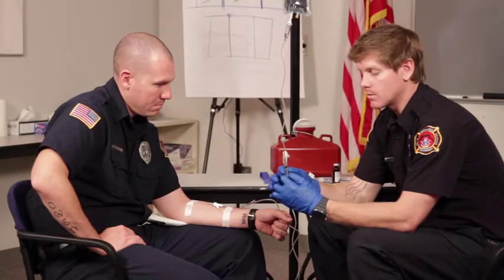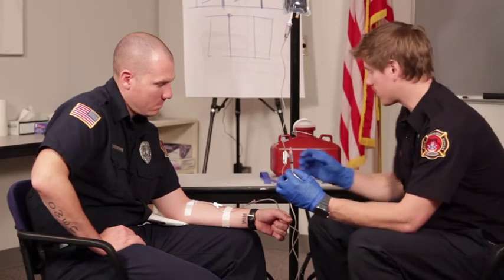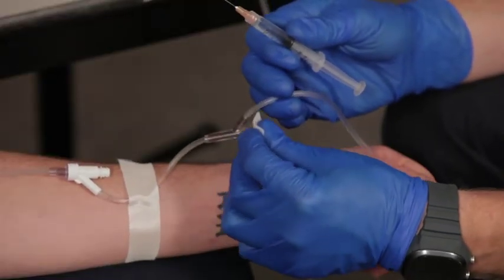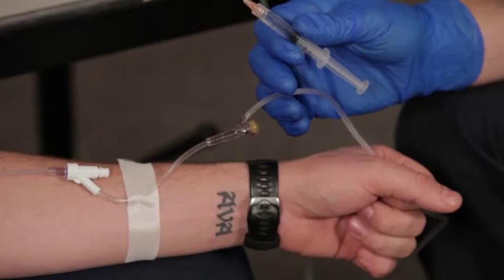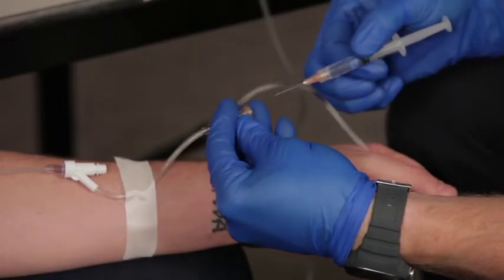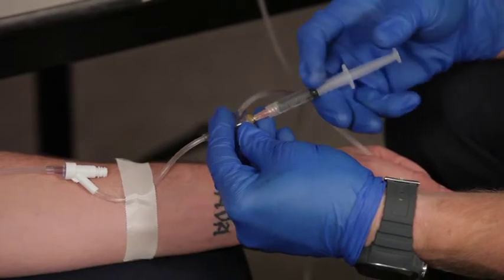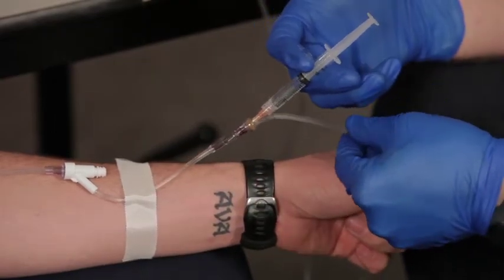Once we have our medication we want to double-check and make sure we still have the right medication before we administer it. Before we insert the needle into the port, we want to make sure to clean it with an alcohol prep. Insert the needle, and before giving the administration we want to make sure and pinch the line.